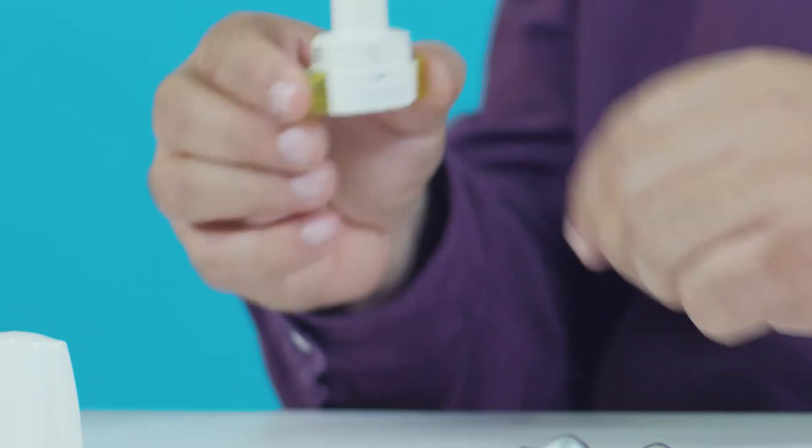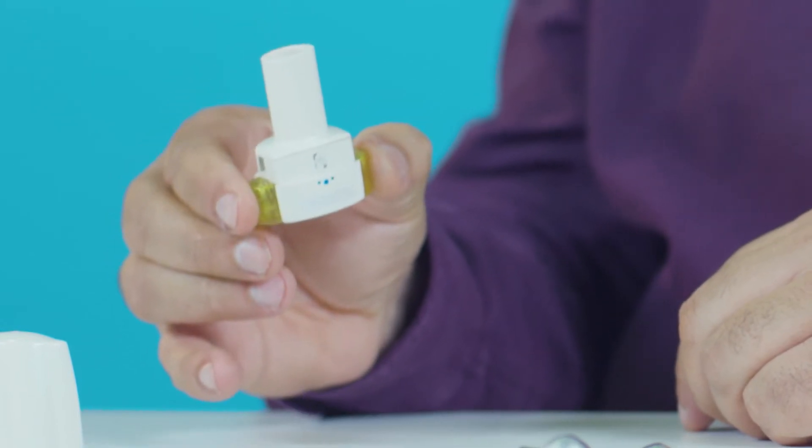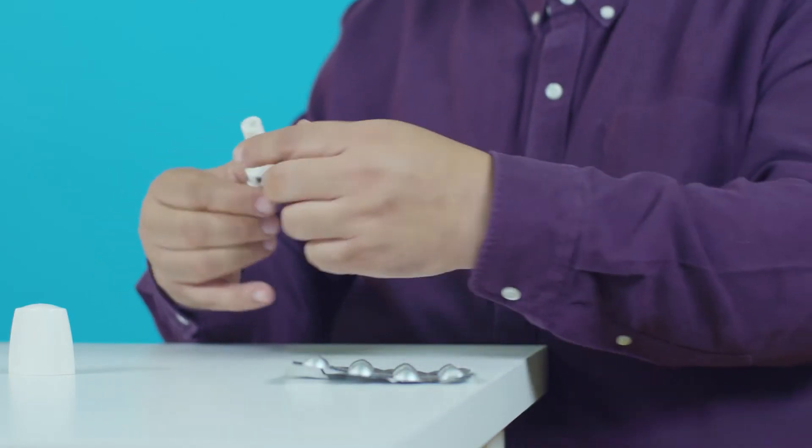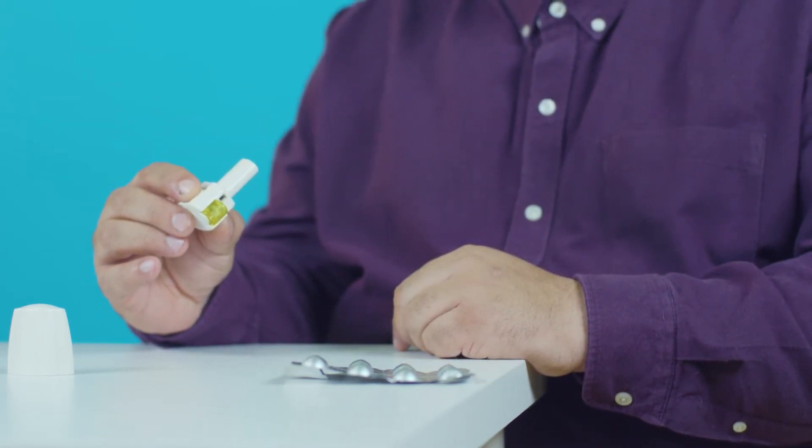Press and release the two buttons at the side of the inhaler to make a hole in the capsule. Your dose is now ready. Hold the inhaler horizontally, but don't tip it upside down as the powder may fall out. Sit or stand up straight and slightly tilt your chin up as it helps the medicine to reach your lungs.